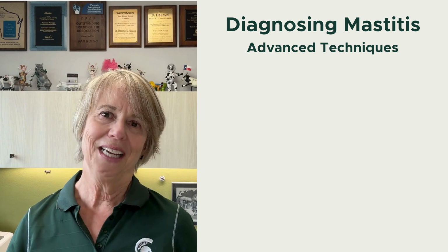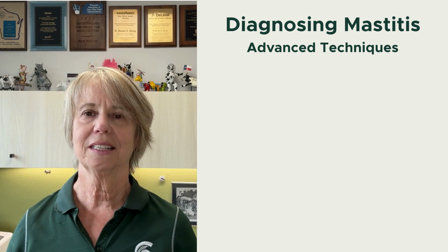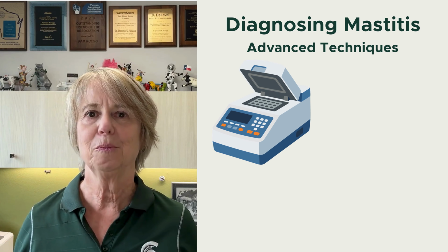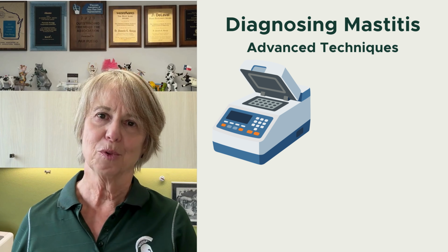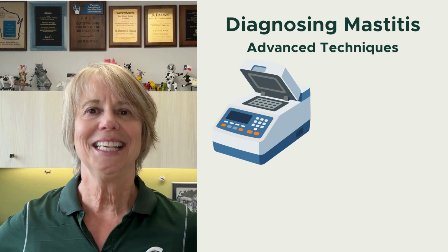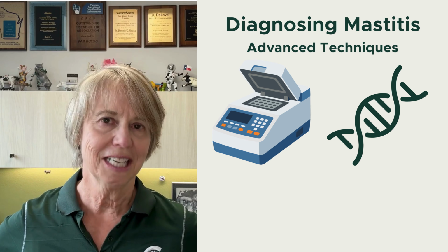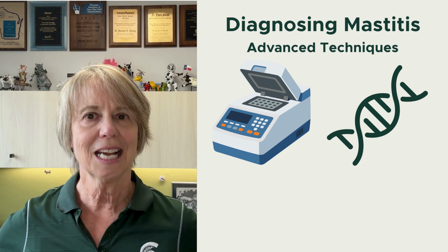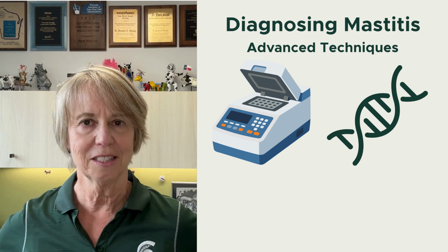Thirdly, we have advanced techniques, molecular techniques such as PCR. These tests are now commonly available, but we need to understand how they work to get the best use of them. PCR testing, for example, detects DNA fragments from both live and dead bacteria. So it's a really sensitive test for determining the type of bacteria in the milk sample, but it can't tell us if the infection is active or has been eliminated.